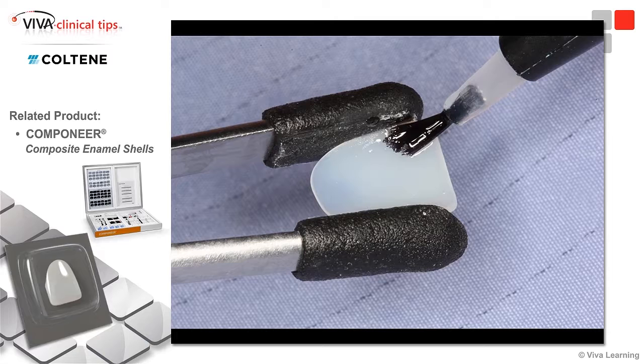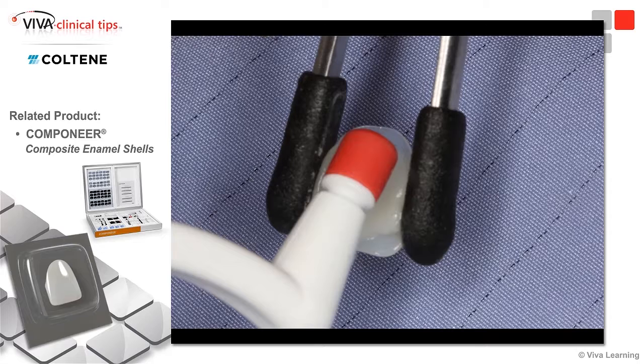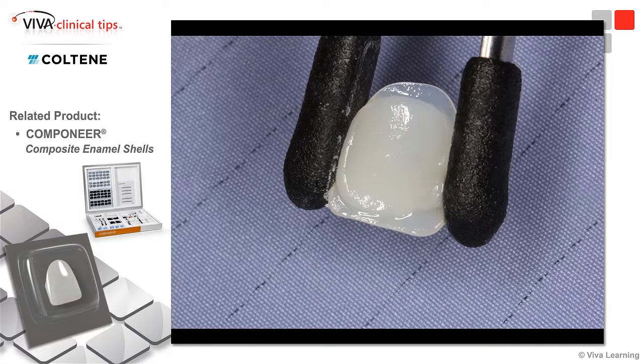Rather than a bonding agent, we don't cure this. We just thin it out and allow it to help the composite that we're going to place in here flow better. And this is Synergy D6 composite. As you can see, I'm just using one of their instruments to coat the internal surface. You want to bring it all the way to the margins, but I wanted to show you that it has significant coverage on the internal surface of the enamel there.